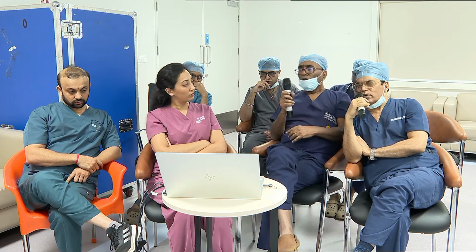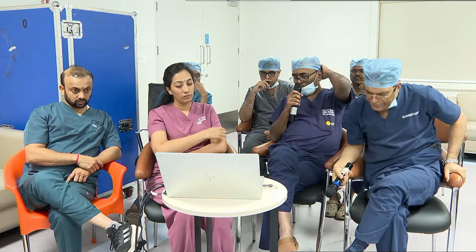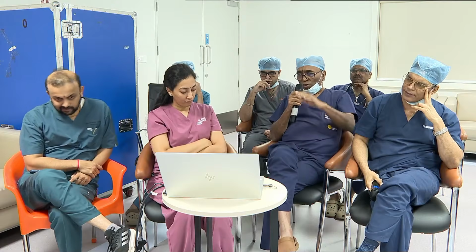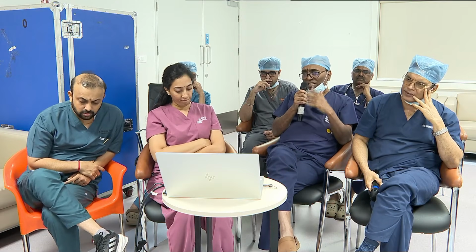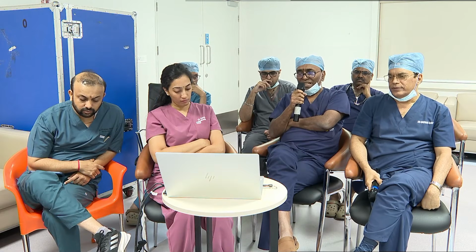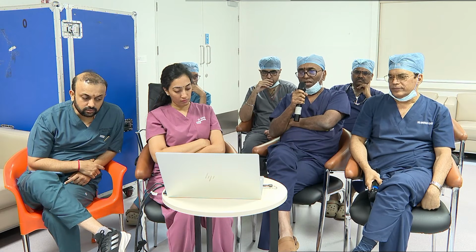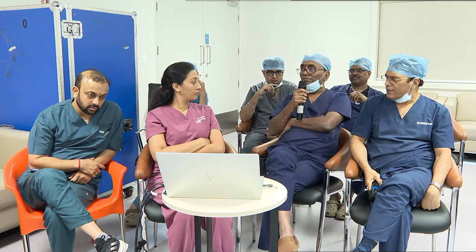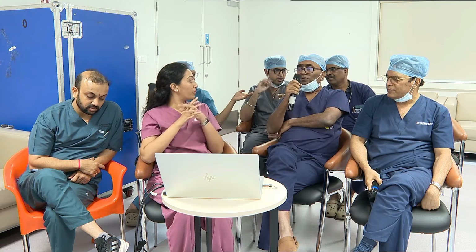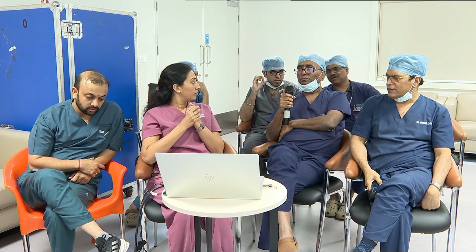So over to Dr. Vijay Kumar. I would like to discuss and interact with our panelists about three important parts. So calcific aortic stenosis is a disease of age. If the patient has got significant CAD, when you plan PCI, before TAVI, during TAVI, post TAVI. Rajaram, Prashant, and others. Shanti, you can discuss before or after. If the CAD is there.